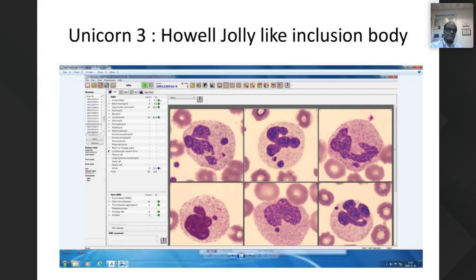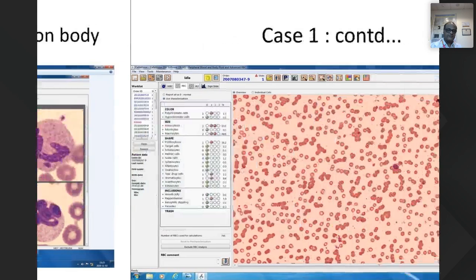It can also happen in myelodysplastic syndrome, or even when the patient is having sepsis. And we saw it in 2 cases of COVID with sepsis also. So such beautiful images can be obtained, which are good for critical thinking, good for the patient, adding value, and you get good efficiency.